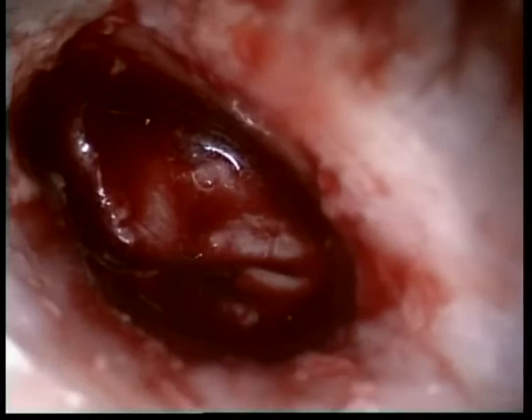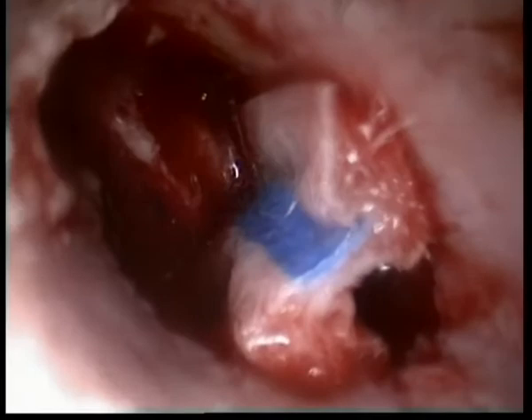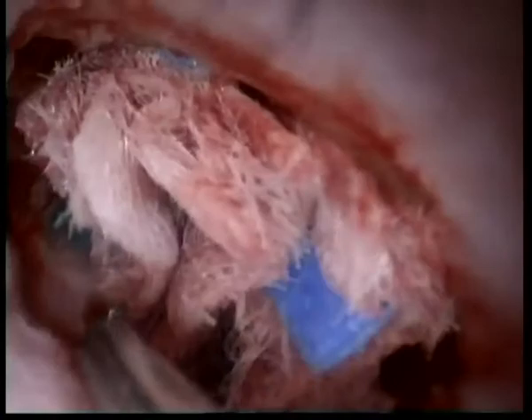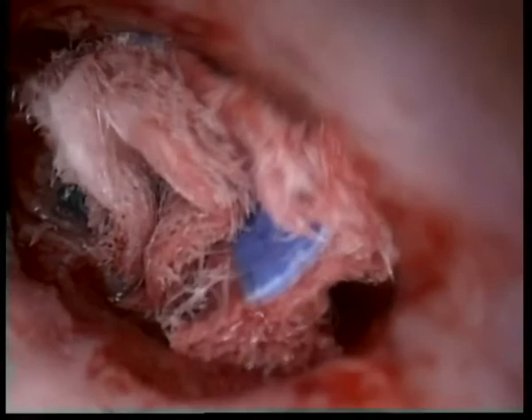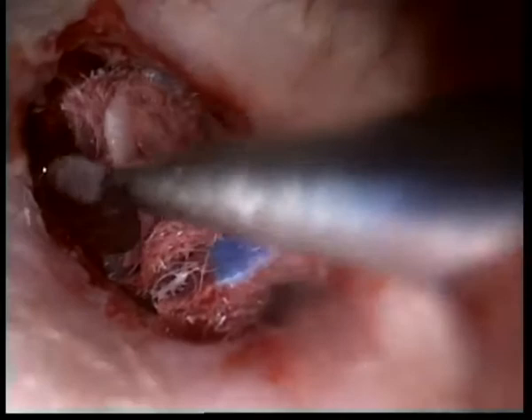Give me another pledget. So we'll split it fairly. Get a wet sponge for me on the field. Give me the round knife, please. So, just trying to elevate superiorly, finishing up the cuts. I explained, it's probably the most difficult part.